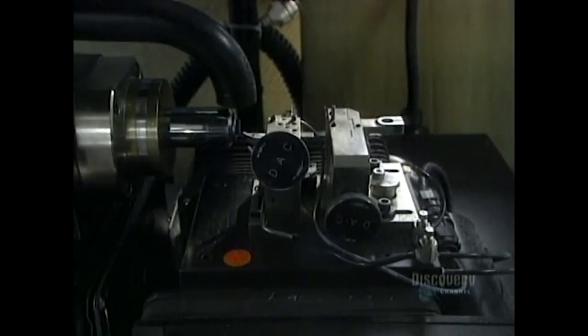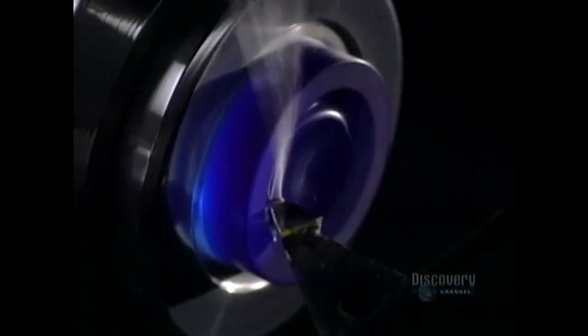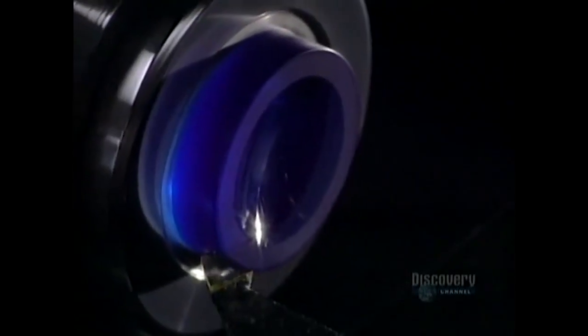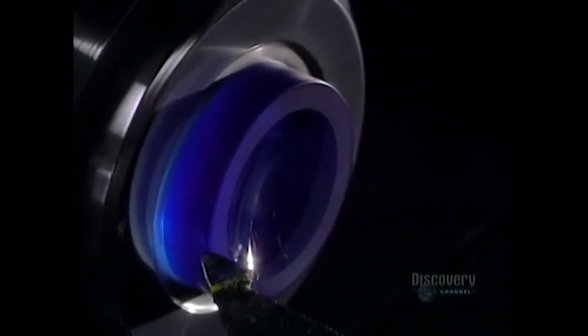They begin by shaping the inner curvature of the lens. This digital lathe, rotating at 6,000 revolutions per minute, is equipped with an industrial diamond. It shapes the inner surface, the part that touches the cornea.